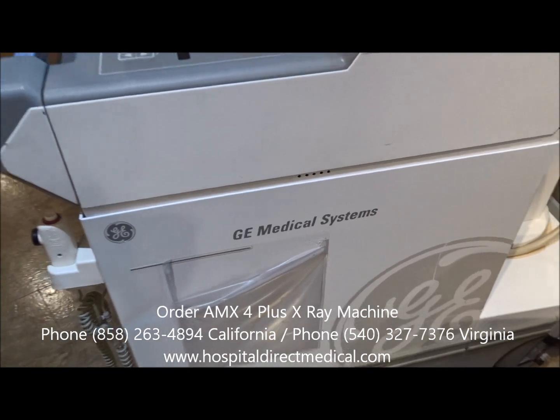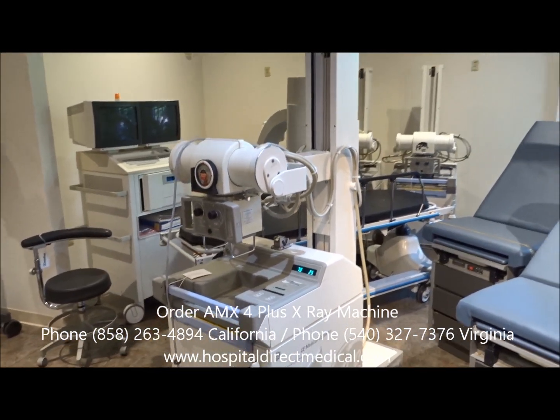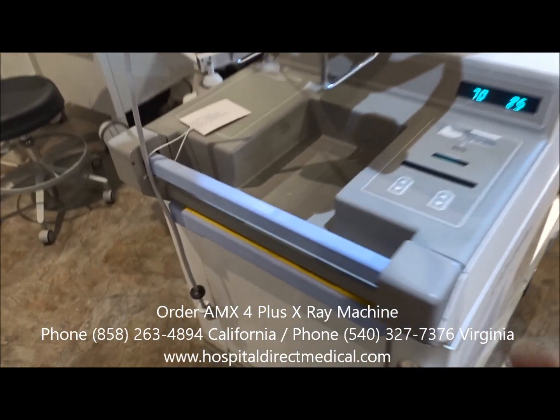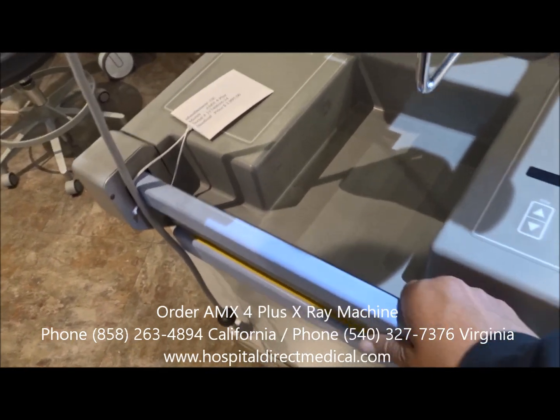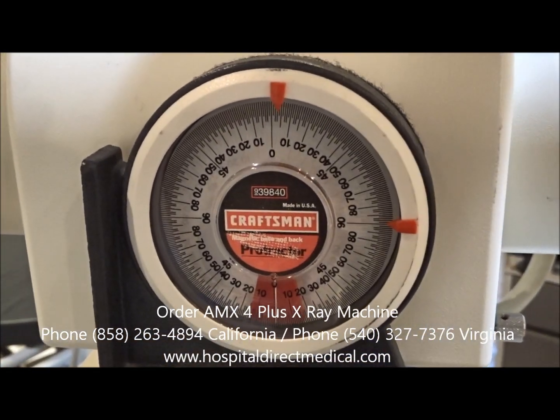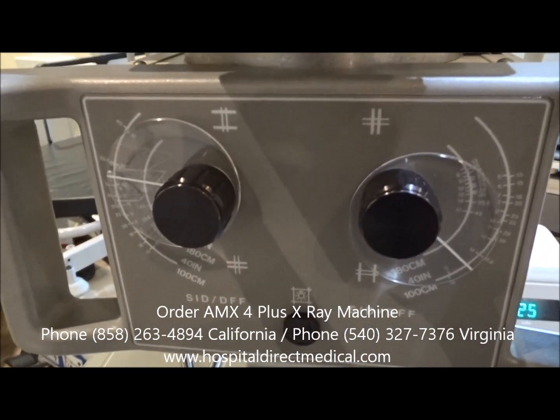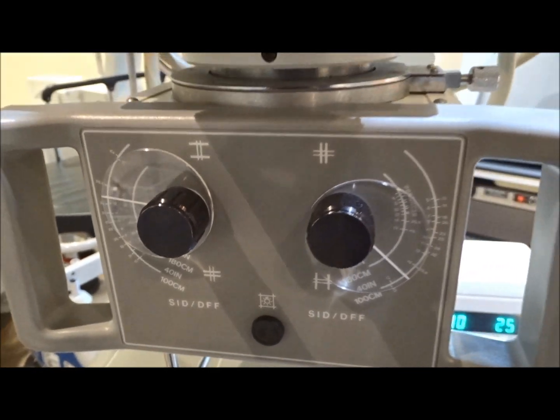We're looking at the GE AMX 4 Plus portable x-ray. It's a very popular portable x-ray. This particular unit is very easy to control with one hand right here — we can move it into position. It'll be used to move down hallways and into patient rooms, and they can do x-rays anywhere pretty much in the hospital. The AMX 4 Plus is known as being a very reliable and durable x-ray machine, and the GE brand is very well known and recognized within hospitals around the United States.